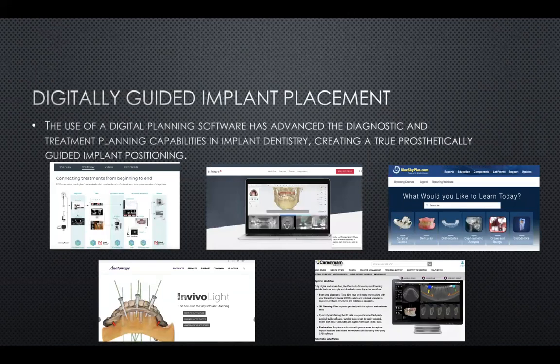With the advancement of intraoral scanners, software, and CBCT scans, we have the privilege now to work with digitally guided implant placement. There are a lot of software packages out there: DTX from Nobel, 3Shape, BlueSky, CareStream, and InVivo from Anatomage, among others.